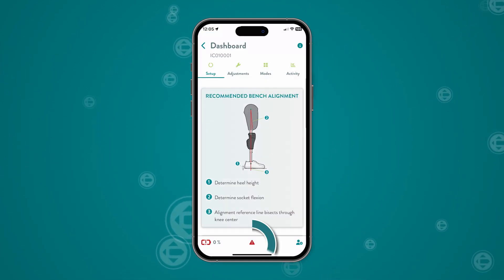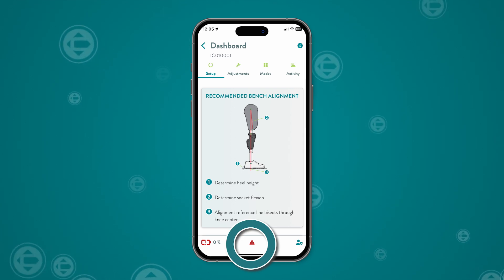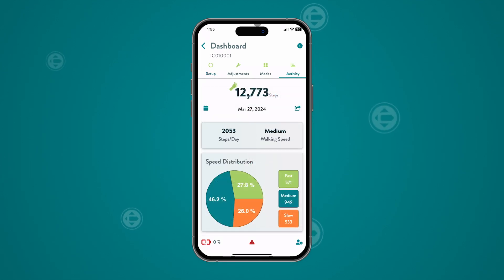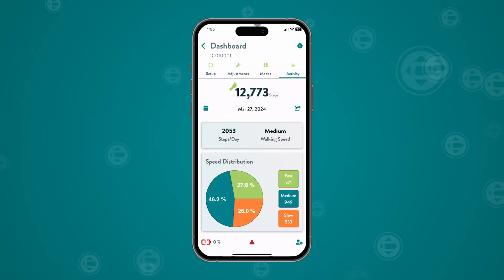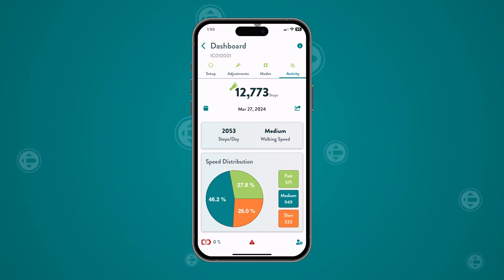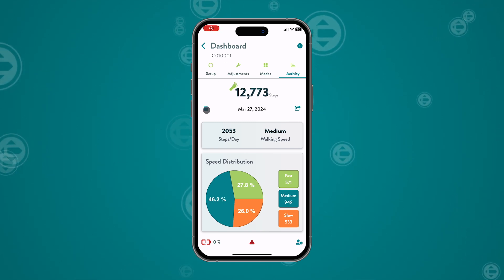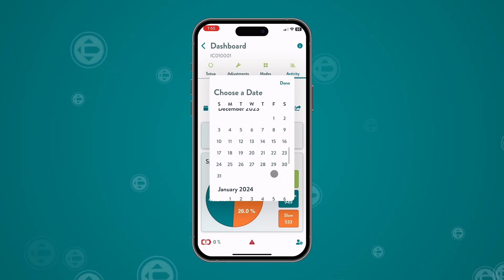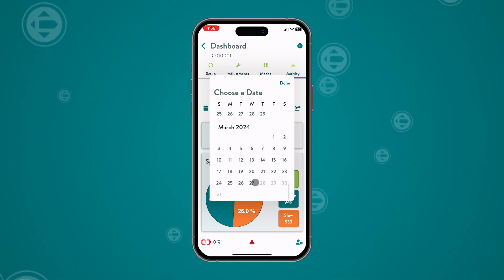System alerts are displayed at the bottom of the screen. They may be referenced if troubleshooting the knee function with College Park. The activity report includes a step counter and also displays the user's walking speed distribution at slow, medium, and fast rates. You can quickly export up to six months of activity data by tapping the calendar and export buttons, which will create a PDF file.